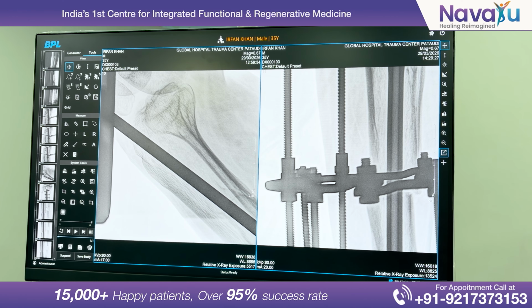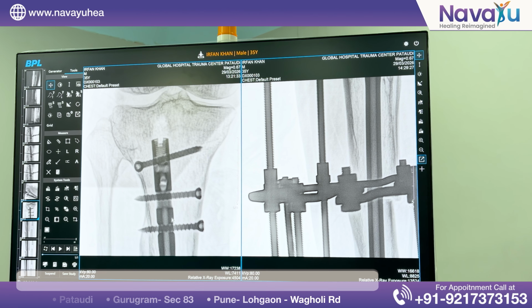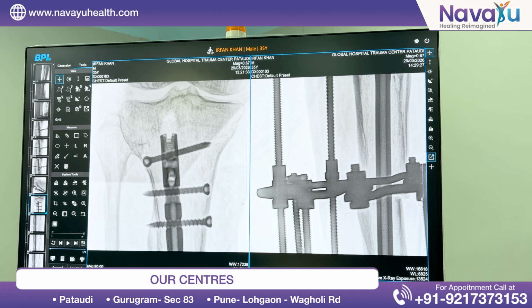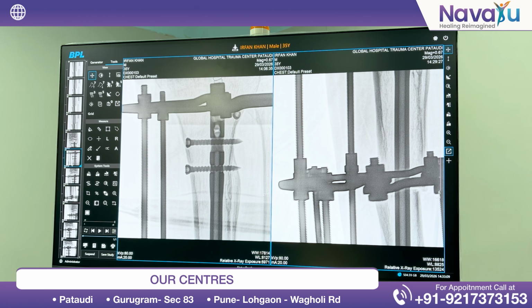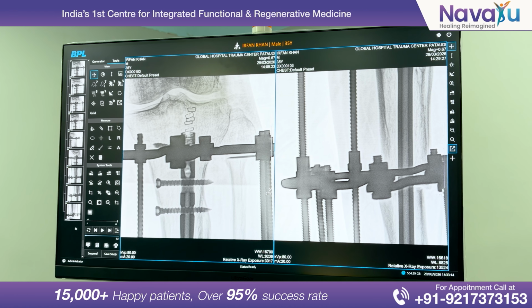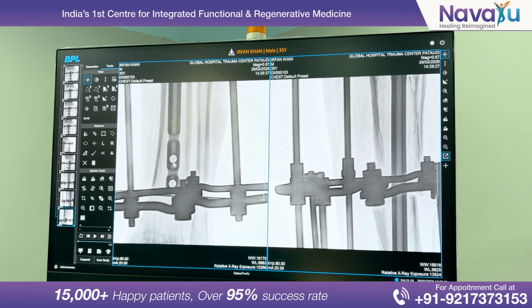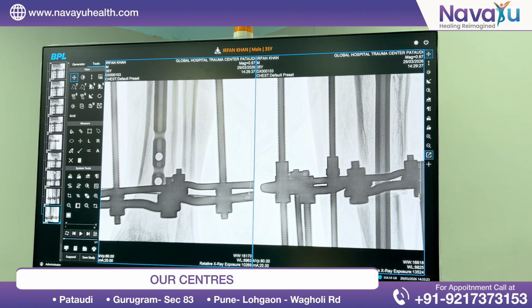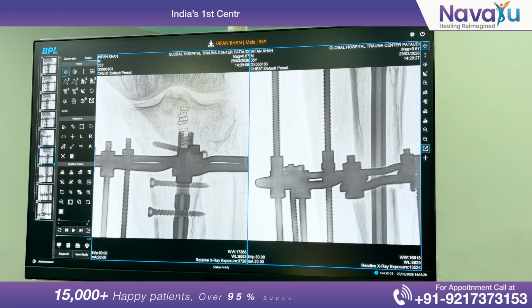I will show you one more. Then we have fixed the nail at the upper side, like in the LON method. This is an expert tibia nail, titanium. We have fixed it with 3 screws so that there will be no rotation. The lower end is free, and now this is how we have fixed with the Ilizarov, with 3 rings. The lower one is the dummy. This is the lowest part. The ring is totally centrally placed. You can see here the roundness, so it indicates that the deformity has been corrected, and we have checked both the AP view as well as the alignment.